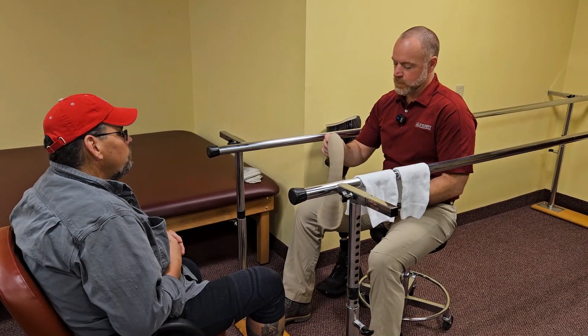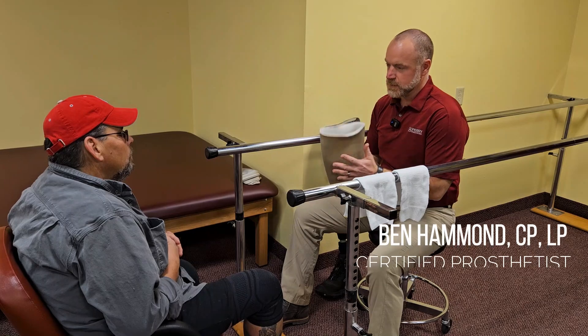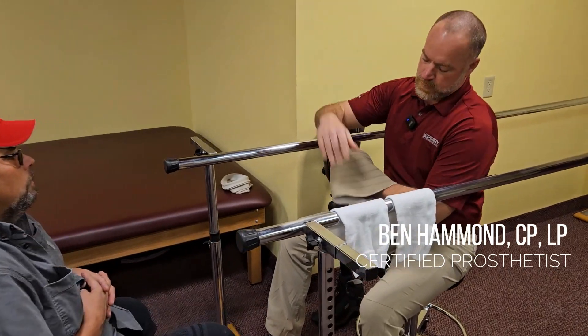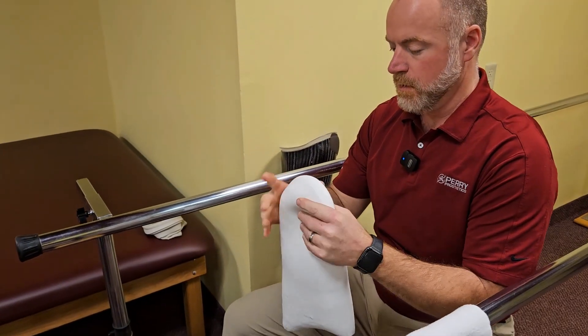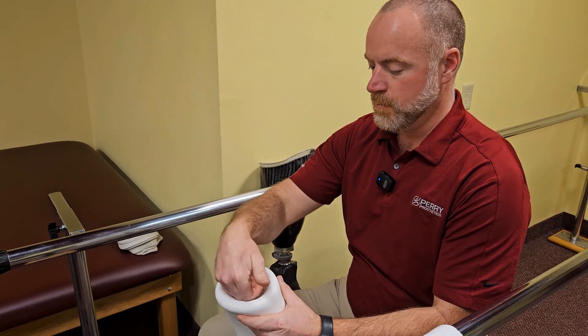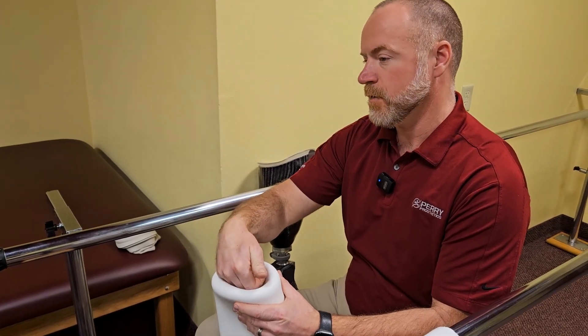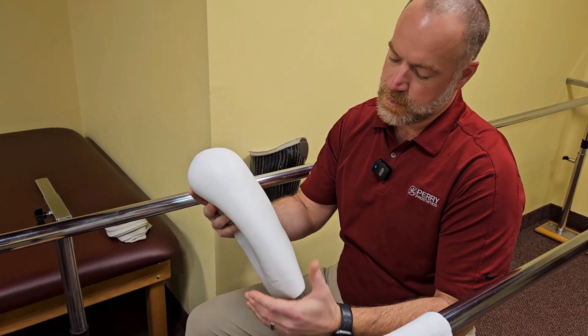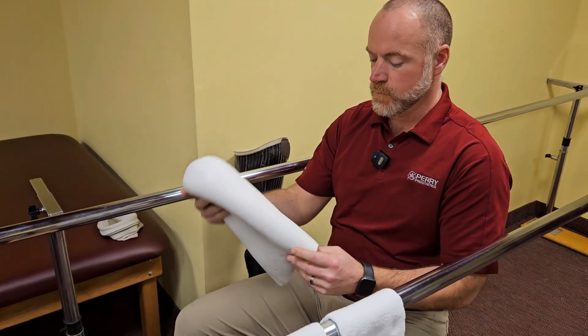Alright Lee, so we're going to don the seal-in liner here. When you put this on, you want to invert it completely inside out. We don't ever want to start the liner with a big hole or bowl in there because that's going to create airspace and cause irritation, potential blisters, plus it's not fully on your leg, which can cause friction and movement.